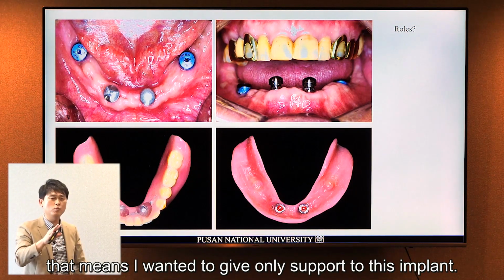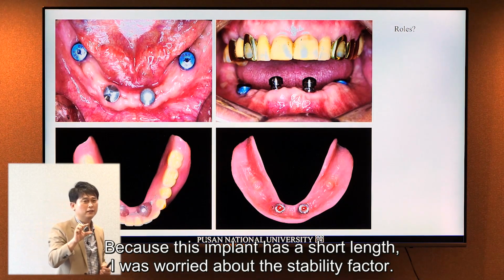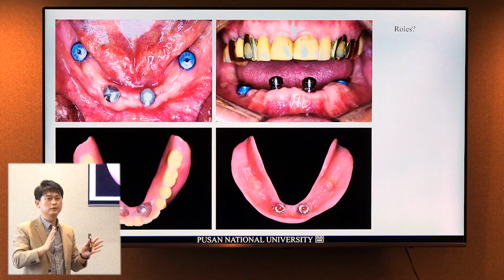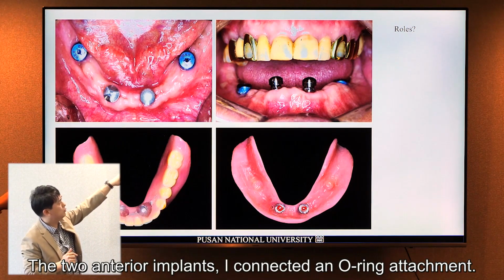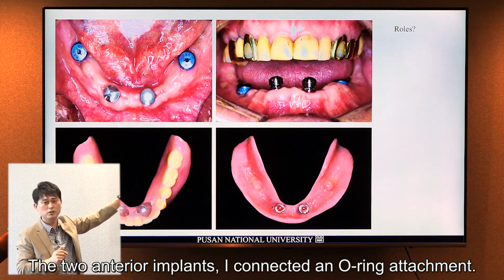That means I want to give only support to these implants, because they have a short length, so I worried about the stability factors. So I didn't connect the locator. And then on the anterior 2 implants, I connected the O-ring attachment.